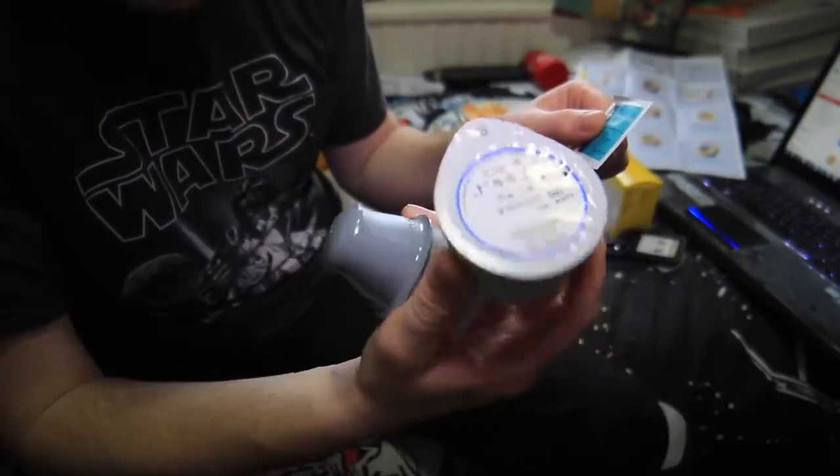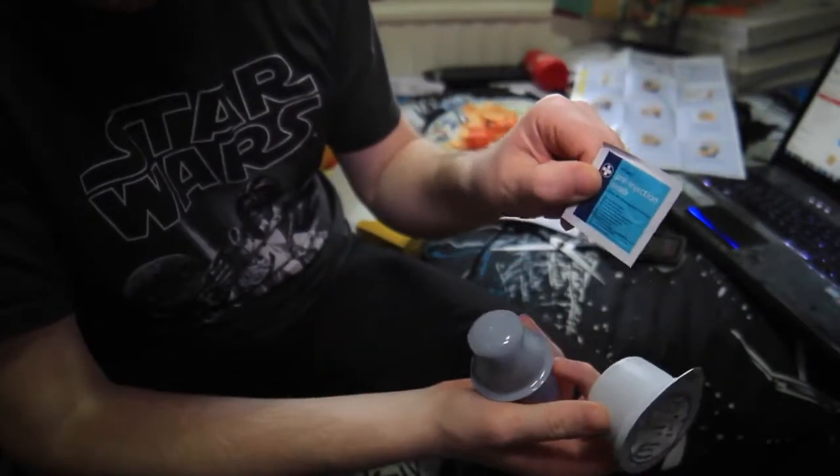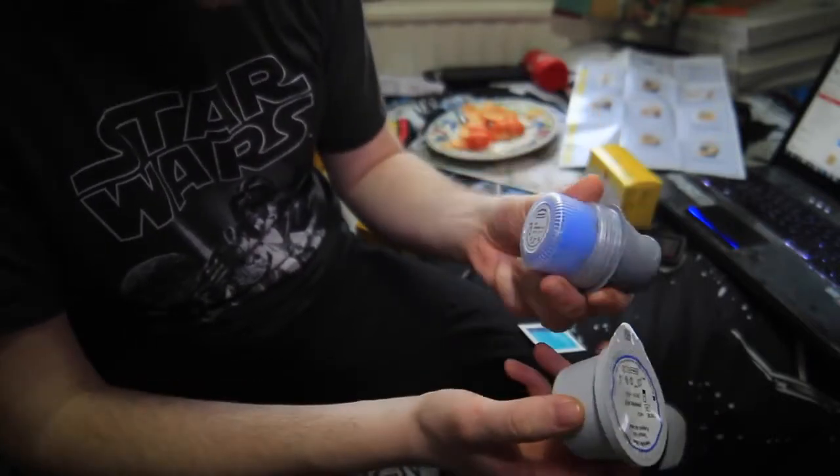I've just opened the sensor box and I've got these here. I think this is the sensor, this is to wipe my arm, and this is some kind of applicator device. I'm going to read the instructions. Step one: select a site on the back of the upper arm — avoid scars, moles, stretch marks, lumps, and insulin injection sites. Rotate sites between applications.